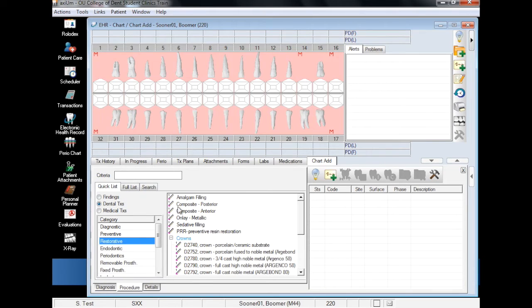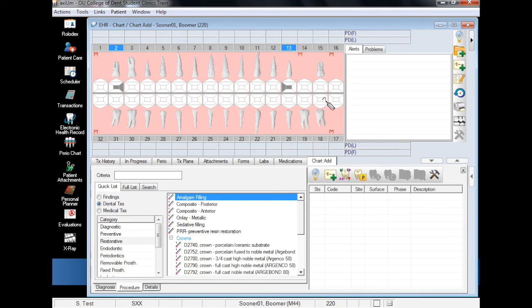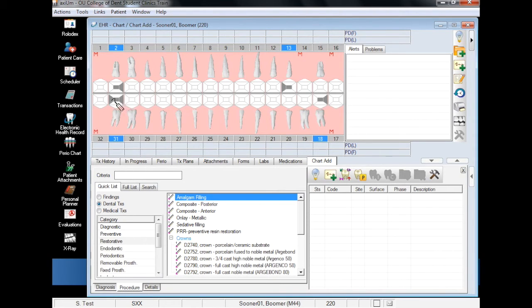Select Amalgam Filling and begin clicking the Odontogram surfaces to record the existing restorations for each tooth. If you add a surface in error, you can simply click the surface again to remove the finding.